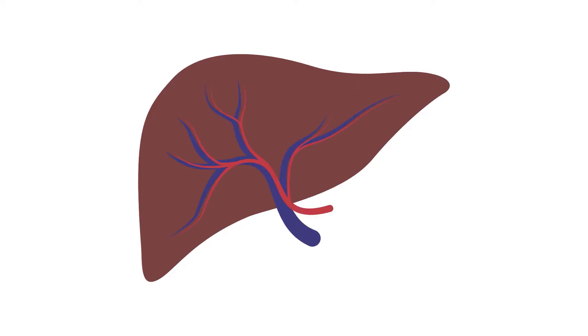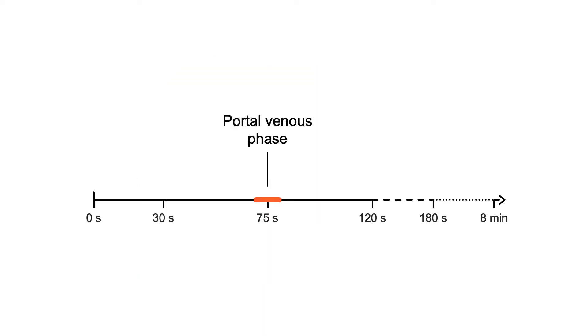We will begin our review of the solid organs with the liver, evaluating the tissue and vasculature. The portal venous phase provides the best balance of solid organ and vascular enhancement for general imaging, and is the most common type of CT performed.